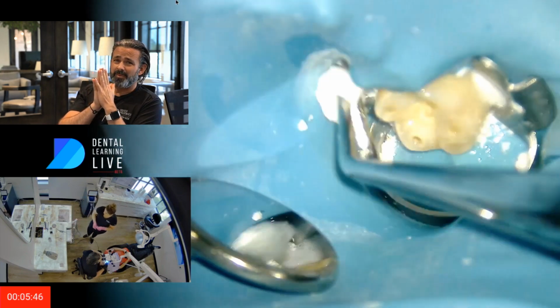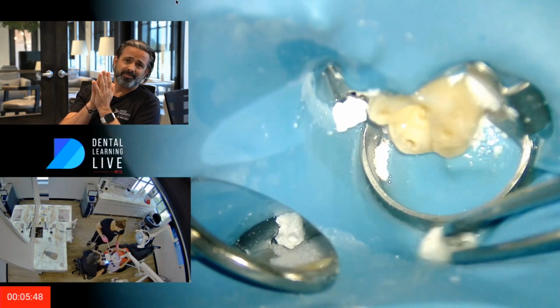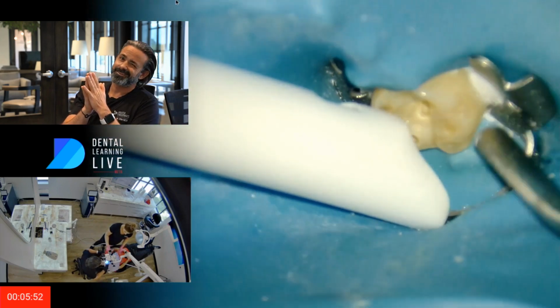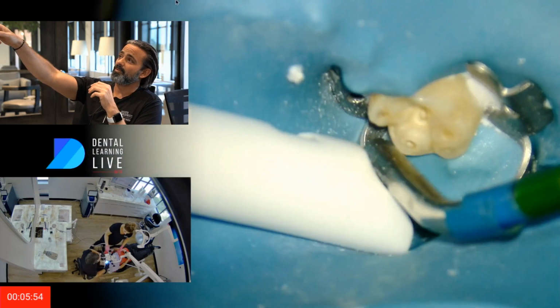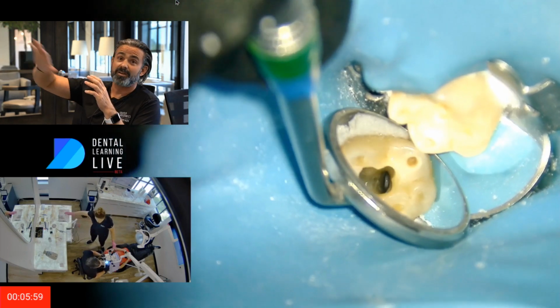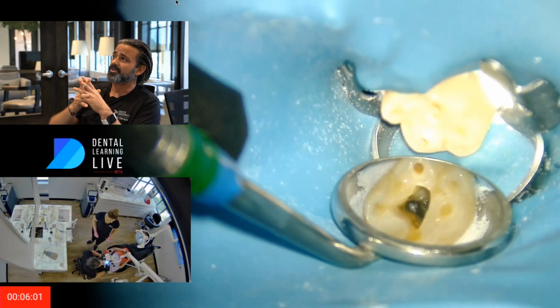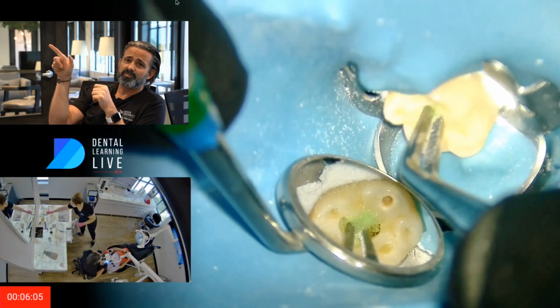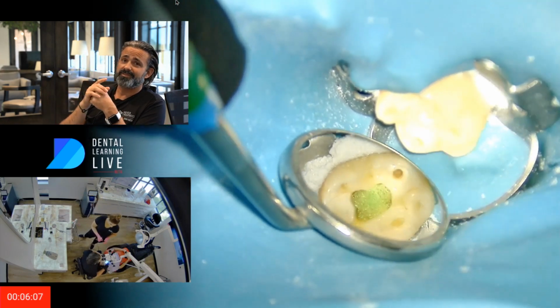Now, remember I told you about the tick? This little boom comes over. It's like Britney Spears in that Pepsi commercial, and she kind of did that wink. Well, if you notice on that screen, it isn't that I'm fidgeting. He is moving out of the field of view. So pay attention to that along this video. I'm moving pretty fast on this video.